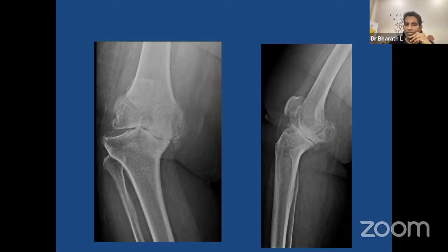And coming to managing the tibial defect, if the tibial defect is less than 10 mm, I would manage it with bone grafting and screws. And definitely, considering the morbidly obese group, you are always going to have in mind that you're going to go for a short cemented stem. So if the defect is less than 5 mm or 5 to 7 mm, you can fill it with cement and go for a completely cemented, short cemented stem. If the defect is major or bigger than 10 mm, you go for a bone graft and go for a longer stem. I think beyond that, I don't see any other challenging task.